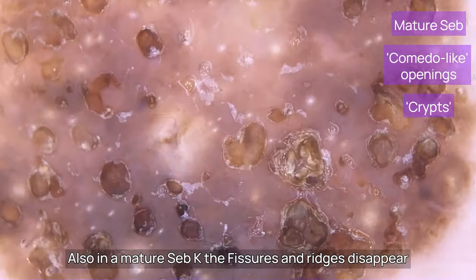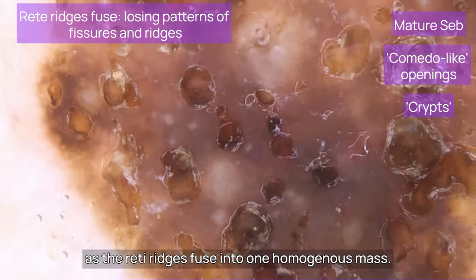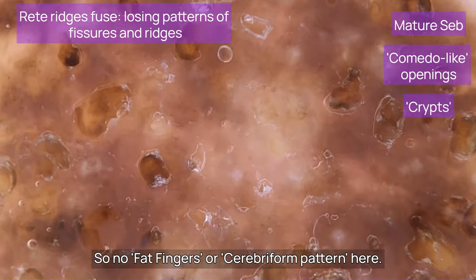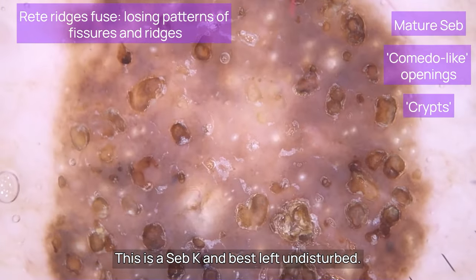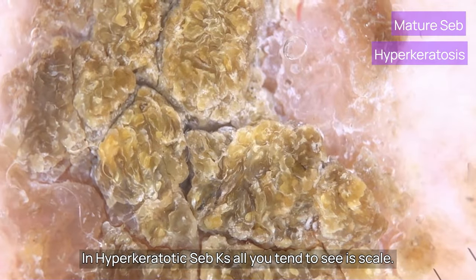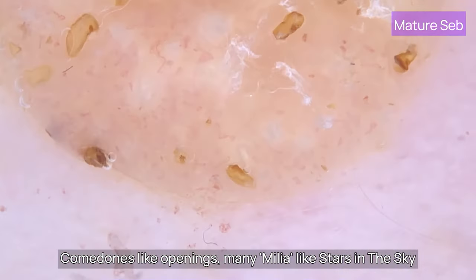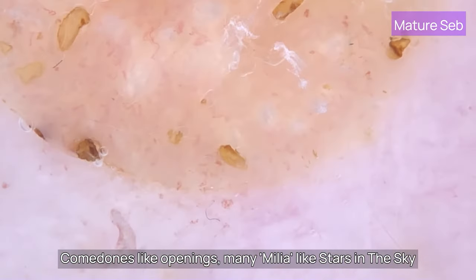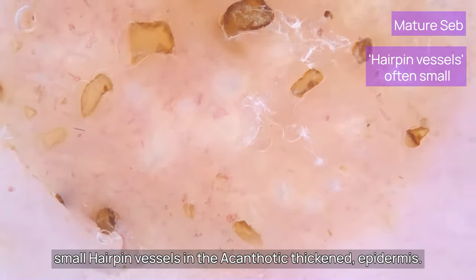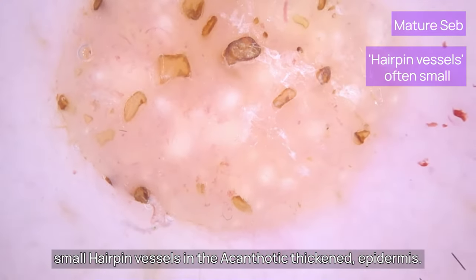In a mature Seb K the fissures and ridges disappear as the retia ridges fuse into one homogeneous mass — so no fat fingers or cerebriform pattern here. This is a Seb K and best left undisturbed. In hyperkeratotic Seb Ks what you tend to see is scale. This more mature Seb K shows comedone-like openings, many milia like stars in the sky, and with no large keratin mass covering it you can see many small hairpin vessels in the acanthotic thickened epidermis.